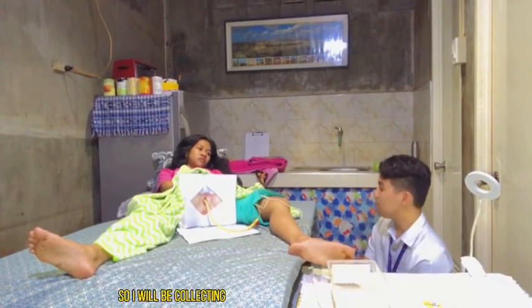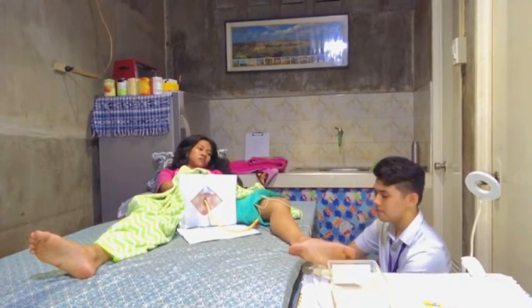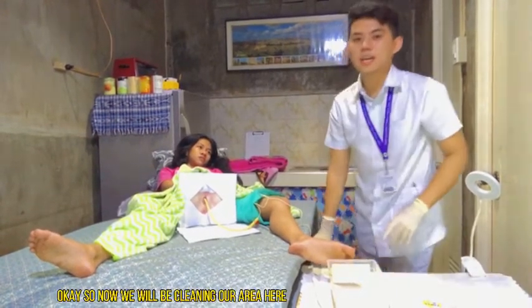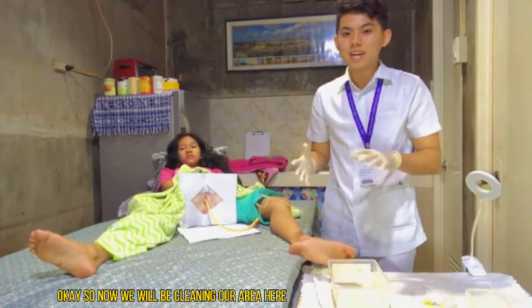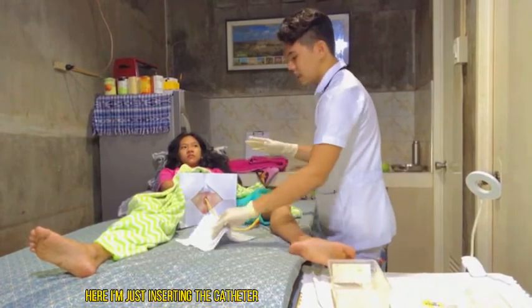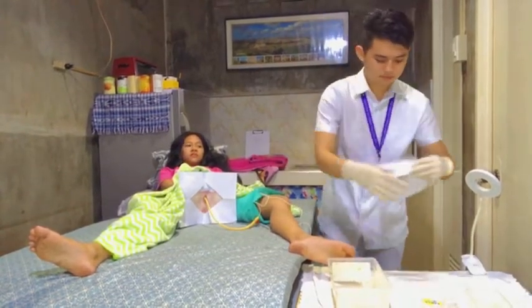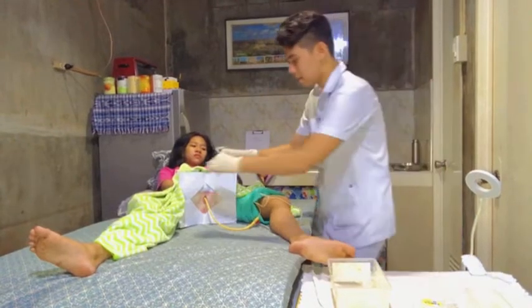Okay, ma'am, so I will be collecting the amounts of the residual urine later, okay? Okay, so now we will be cleaning our area here. So as I have said earlier, I'm just inserting the catheter and cleaning the area, okay? Trash can.